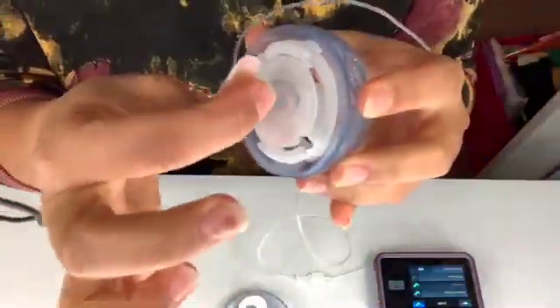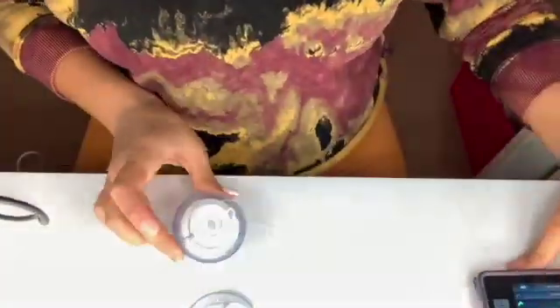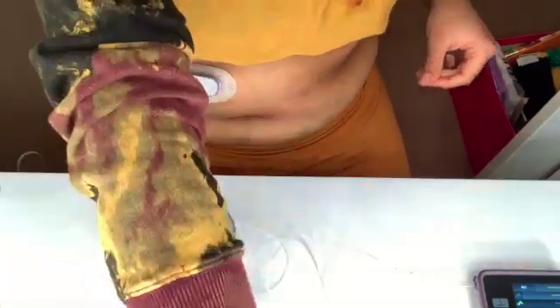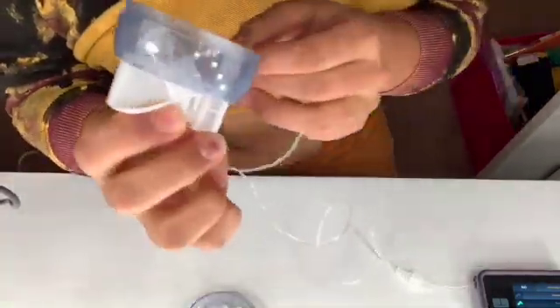pump. But in order to do that, we need to take off the backing, take off this little paper right here to reveal the sticky part that will stick to your skin, and to take off the tubing for the thing. And as you can see right here, the spot where I had my inset before is a little irritated. It had started bleeding, and sometimes it does that, so don't be afraid if that happens. But make sure, like I was saying earlier, make sure you put your new inset in a different spot. Don't ever do the same spots again, just because it'll harden your skin.